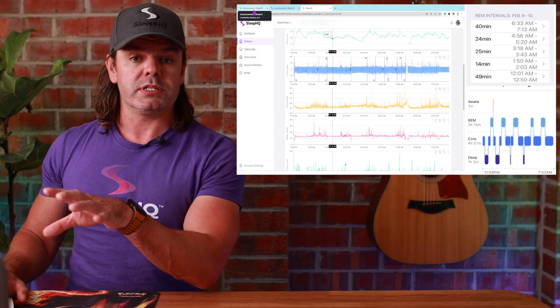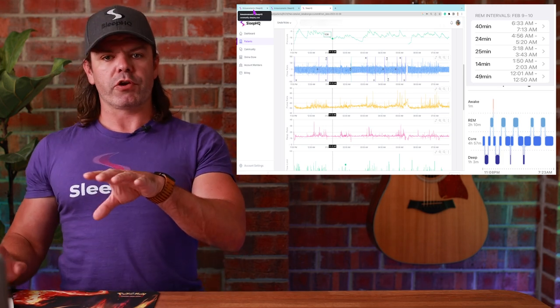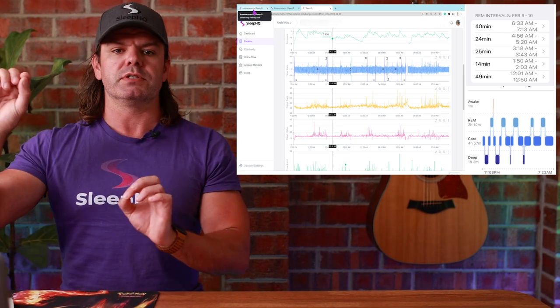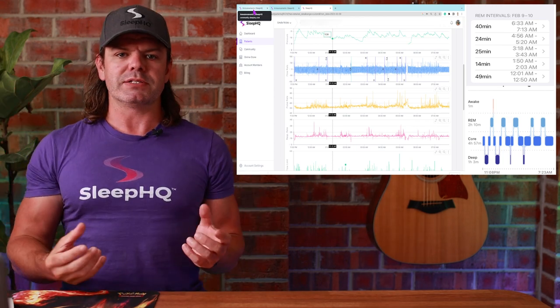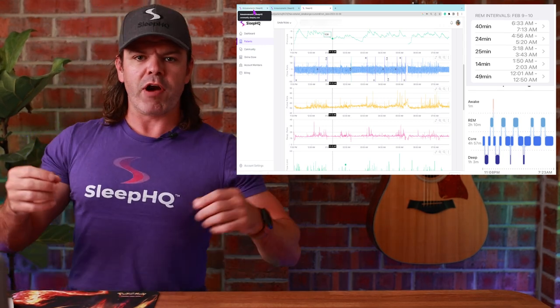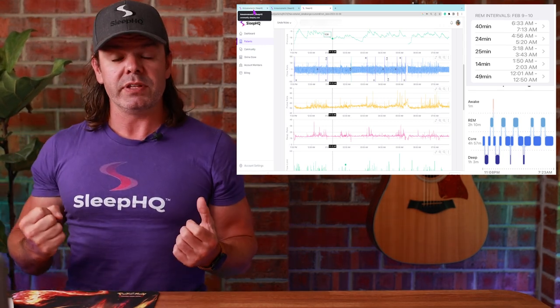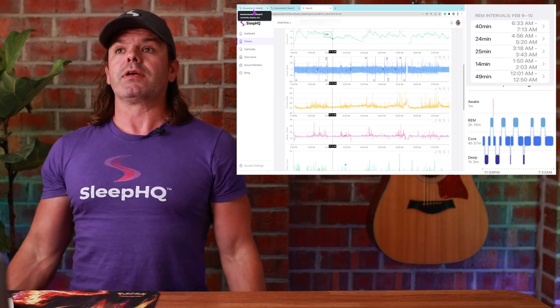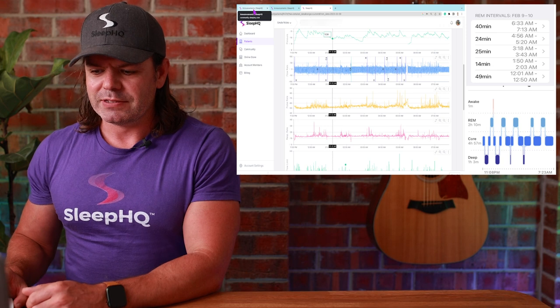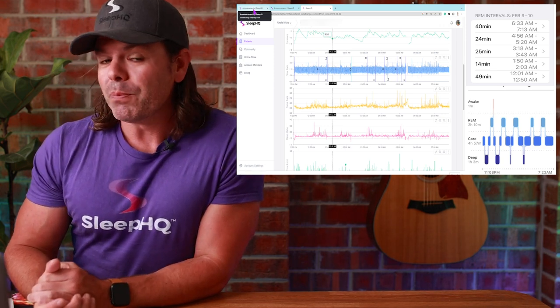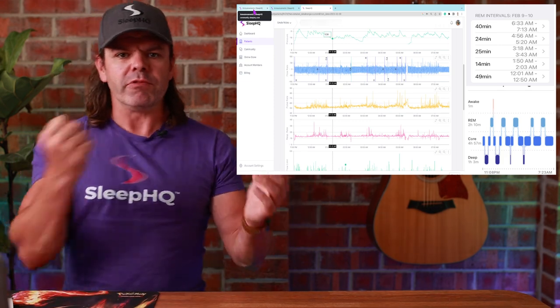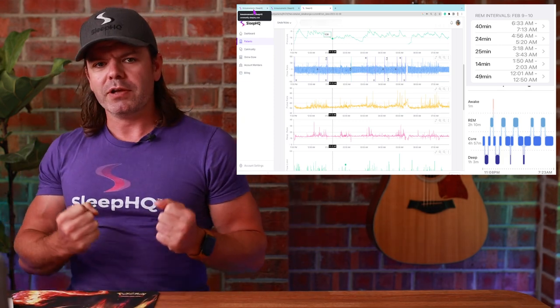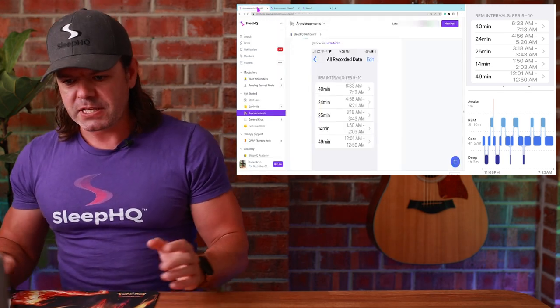Sometimes what you'll normally see is during those REM periods, you will see an increase in the automatic pressure most of the time, because of the atonia where your muscles relax. Your body basically becomes paralyzed during REM sleep. Your brain, your heart, everything's really active inside. But your body, your muscles, you're like a mummy. And they're not sure why, but research believe it's so you don't go acting out your dreams. You know, reach across and slog the misses when you think you're in a boxing match with Mike Tyson.